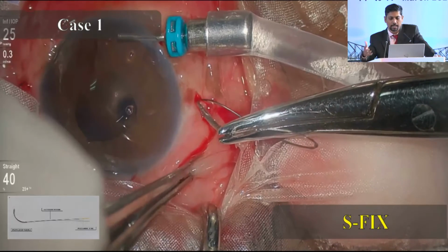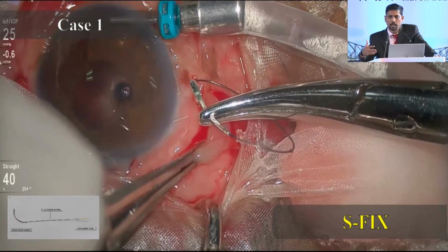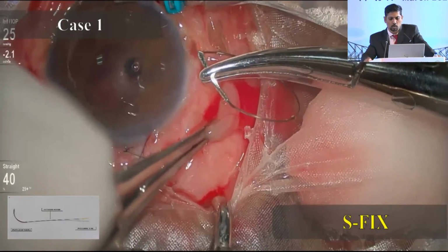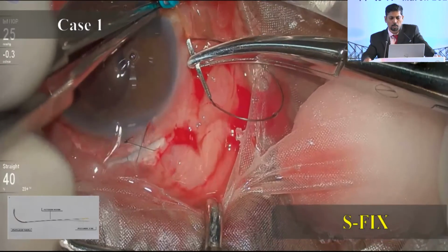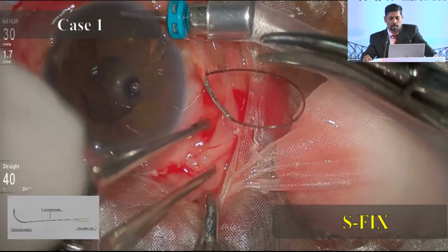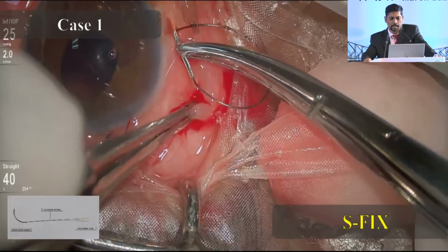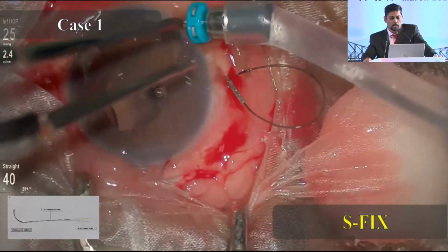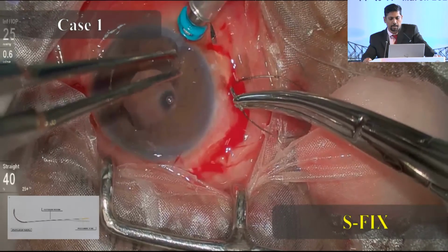Then take a simple suture bite. Again, we are not doing anything intraocular. Suture and needle are something we as ophthalmologists are so used to. So as an anterior segment surgeon, I'm sure you will be able to do this. Take a suture bite. Around 2 mm should be fine. Don't take a long bite over there at partial thickness sclera. So once you are done with this suture bite, retrieve it.